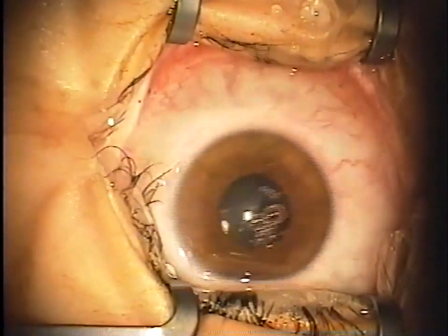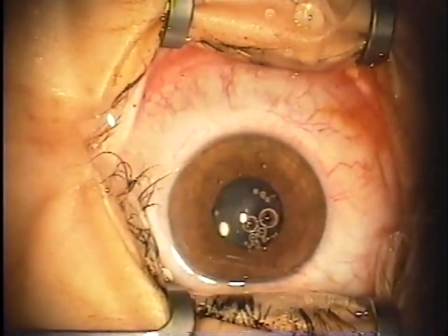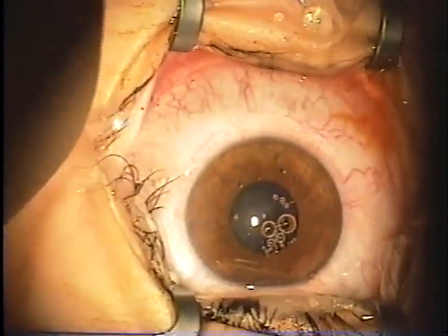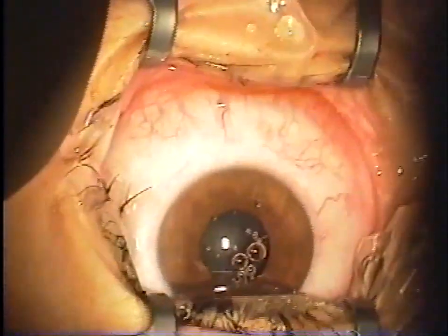As I do with all my intraocular procedures, just drop a dilute betadine there on the ocular surface to prevent infection and remove the speculum, and we're done. Patient sits up and has fantastic vision.